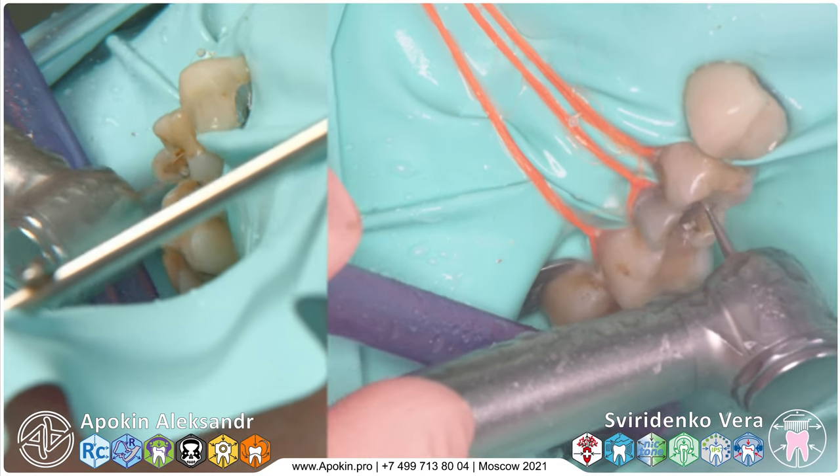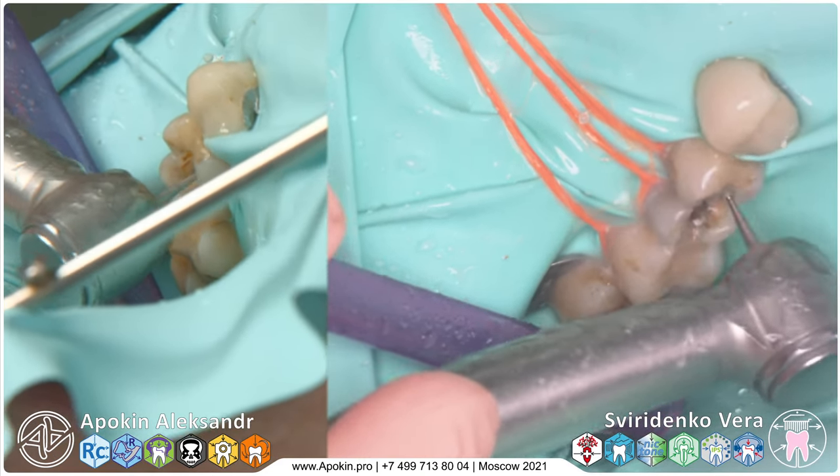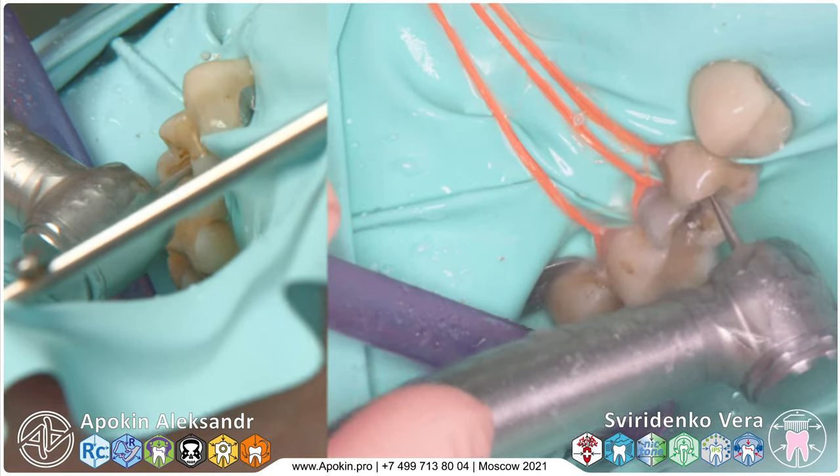Also, we decide to add an additional ligature around the canine.